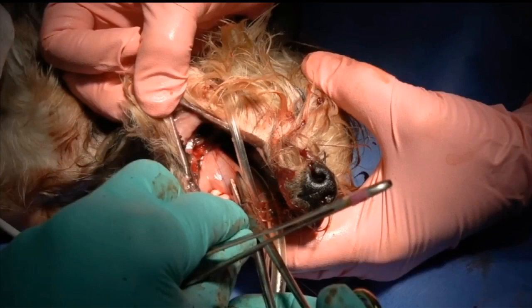This is my veterinary dental technician — she's a VTS in dentistry and one of the best instructors in veterinary technician dentistry. She is holding this patient's commissure back with her right hand, and with her left hand between her middle finger and index finger, she's holding that mouth open and steadying the back of the head with her thumb, pointing the patient pretty much directly at me — which makes for a very easy closure.